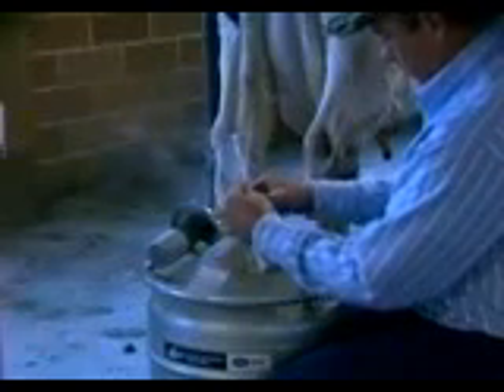When handling semen, one must not bring the canister completely out of the tank, but work down to the neck, which we call the frost line, which can be seen. The cane then can be brought up with the semen that you're interested in. It should be brought up, dropped down immediately, then the canister, and then we can immediately go and drop that into the water bath.